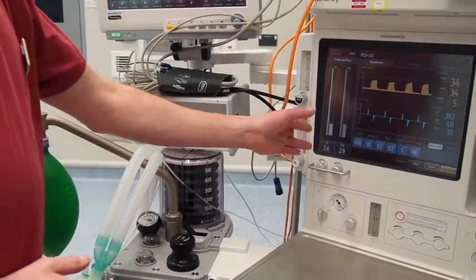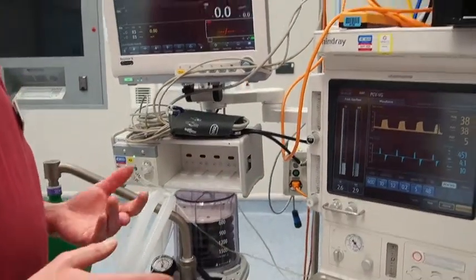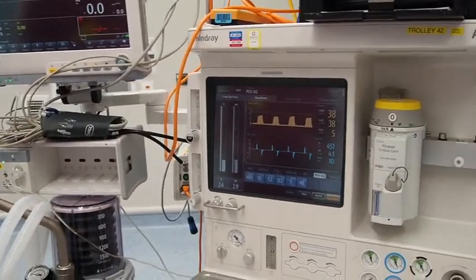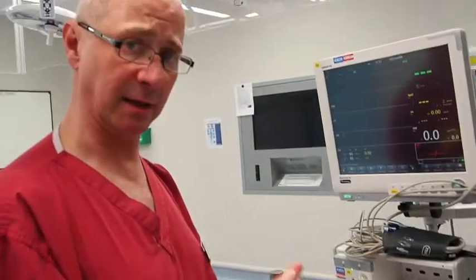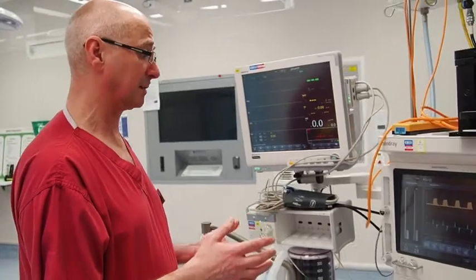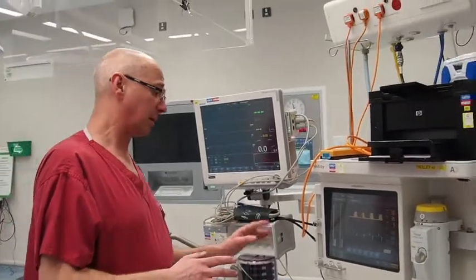And you may wonder, well, why can we change all these different flow rates? The reason is that this machine is designed to use low flows to save money and to use less volatile anaesthetic, which is very important for giving anaesthetics, but for intensive care it doesn't matter so much. So what numbers will you start to set on?